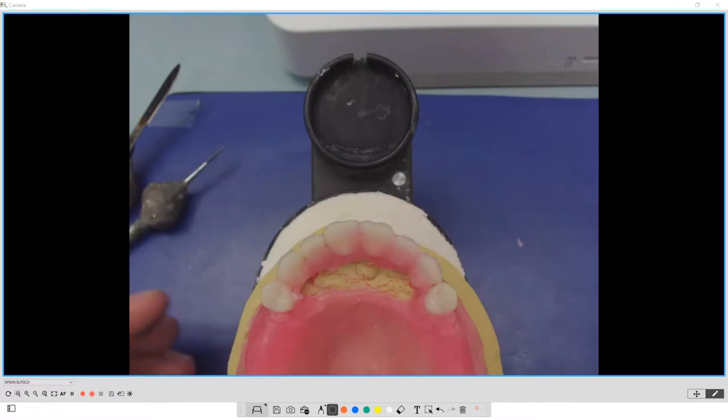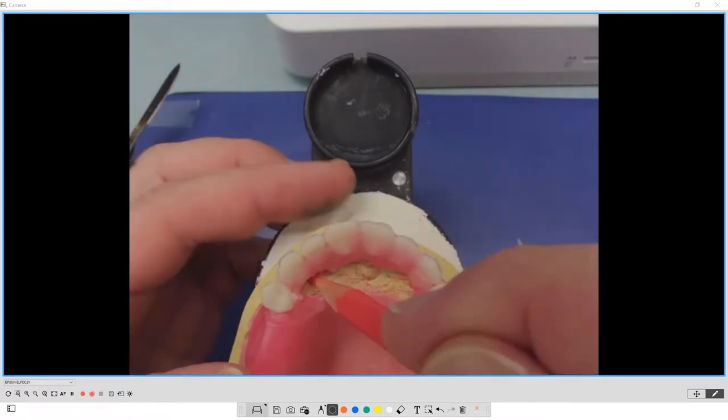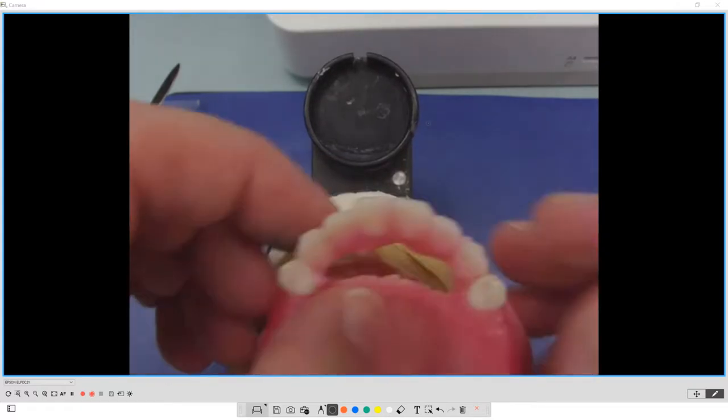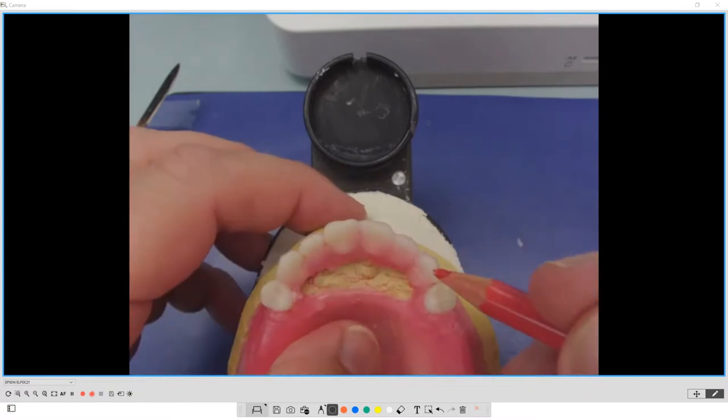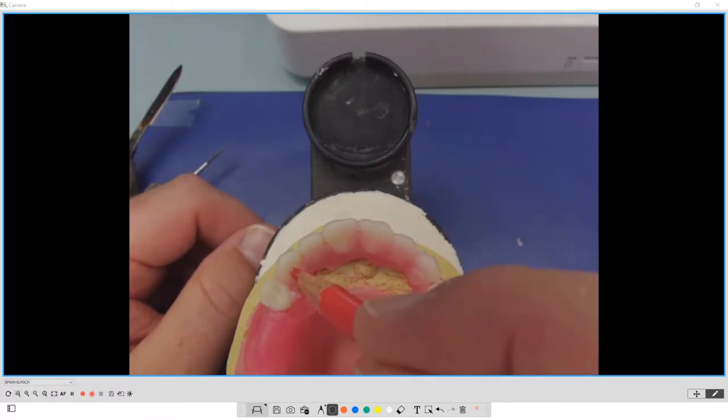And so now when you put this on and I take a look, remember where my dots were? So the dots right here, look, that's right where the cuspid is. Okay. And the dot right here, and it's showing me that I'm really close to where the cuspid is. So I have plus or minus a millimeter. So what happens is this then allows me to show that the cuspids are in an anatomically correct position for this patient. So that's why we know this to be true.